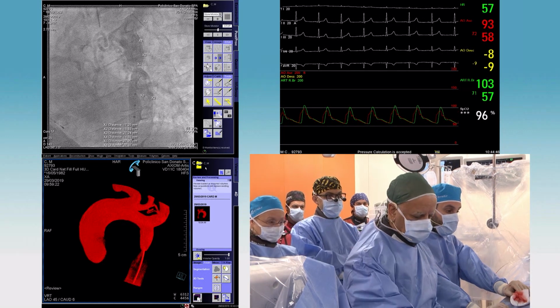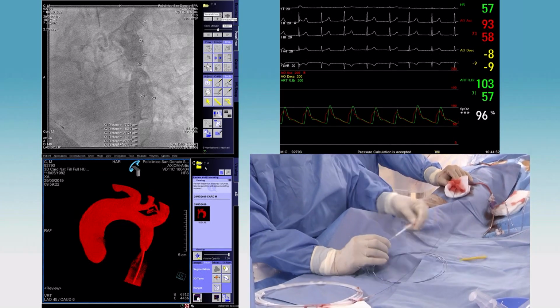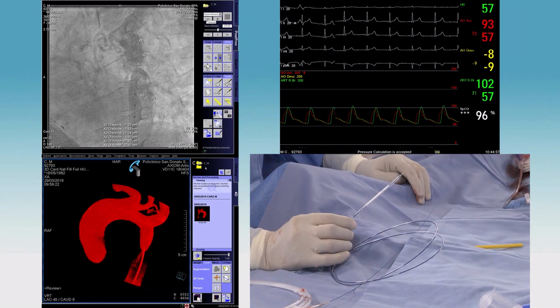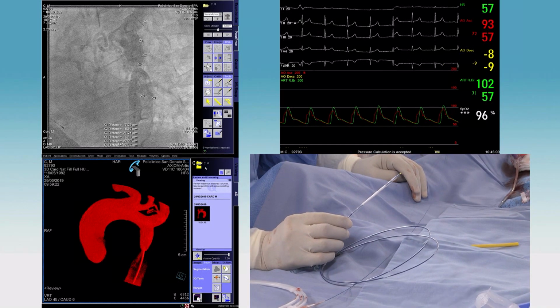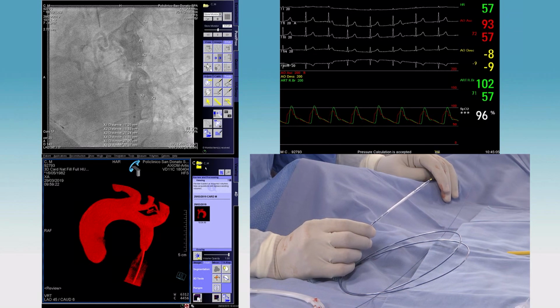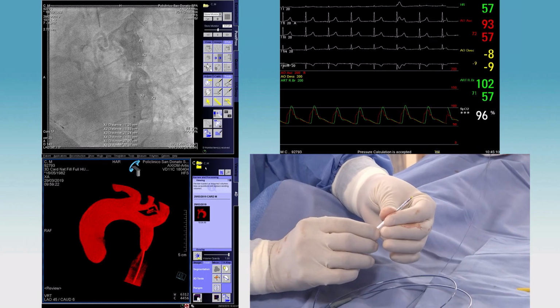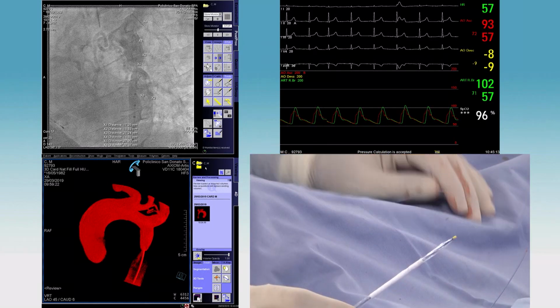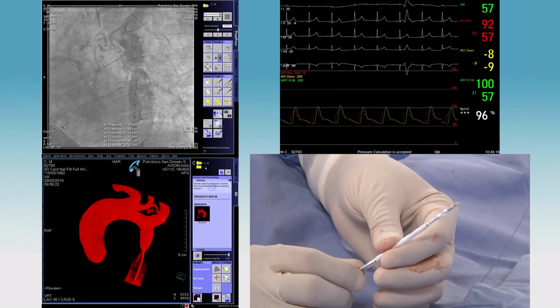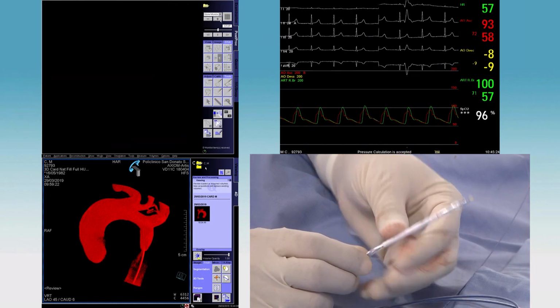So we are not going to use the CP stent. We're going to use the Bentley B graft, which I happen to have here. Now, this is pre-mounted, so obviously I don't have to waste too much time mounting it. However, even when it's pre-mounted, it has a tendency to slip, so you still have to crimp it down. So we've done the crimping down already. Well, I haven't. Lucienne has, because she's stronger than me. And so now, with Lucienne's strength, you can't see it moving at all, yeah?